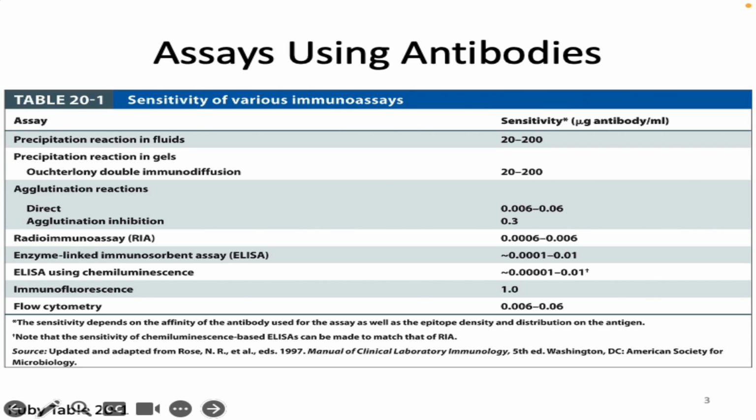Then you swab your nose and put some liquid, and you touch that right here. Now you made the paper wet. And if the paper gets wet, the liquid flows all the way across and all this stuff mixes together. And if there was SARS-CoV-2, now the SARS-CoV-2 would bind here. And it would also bind to the color thing. And you get a color all of a sudden, where there used to not be one on your filter paper. And this one is a control that basically binds to anything. And so you always get a line there to tell you that the test worked. And so basically what you're doing is you're just allowing capillary action to flow some liquid, maybe with SARS-CoV-2, maybe not, down a piece of filter paper.